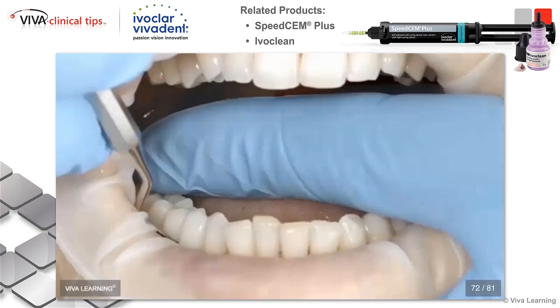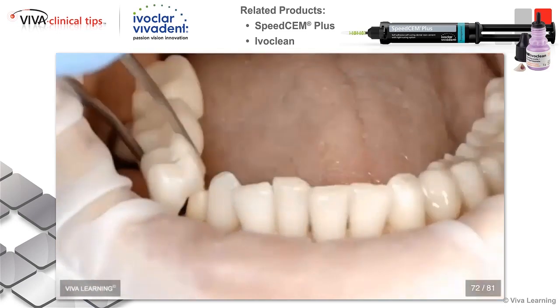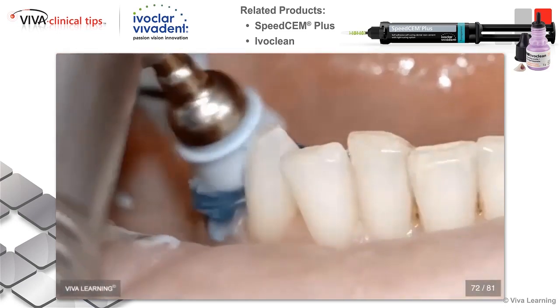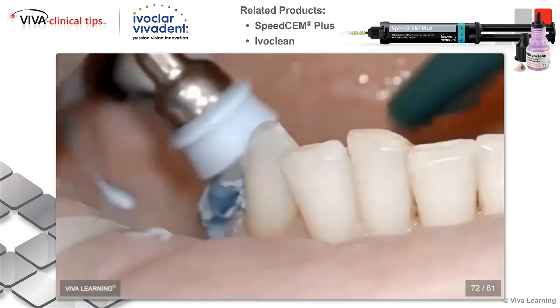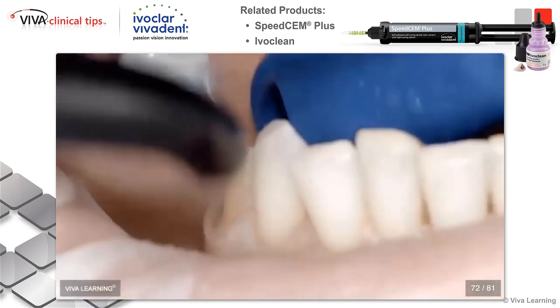And here's an example. Let's take a look at the steps as we're placing this into a mouth with the SpeedCEM Plus. So step one is to remove the temporary bridge, lifting it off here with a sickle scaler. And then we need to clean the tooth preparations to make sure that they're free of debris and temporary cement. So we're using Proxit Medium, a fluoride-free prophy paste, to ensure that we've got nice, clean preparations.